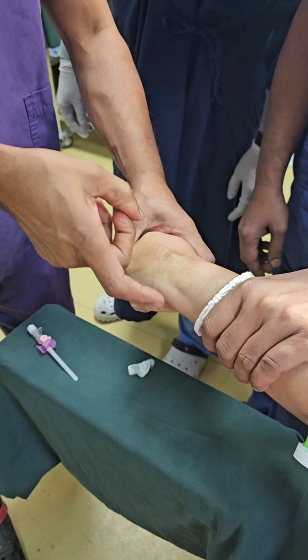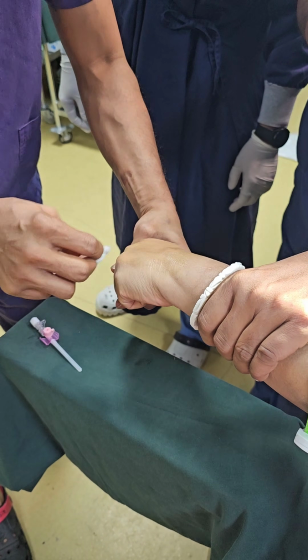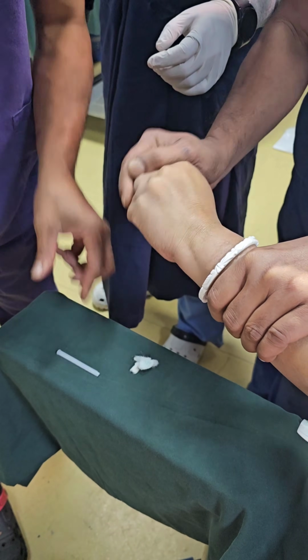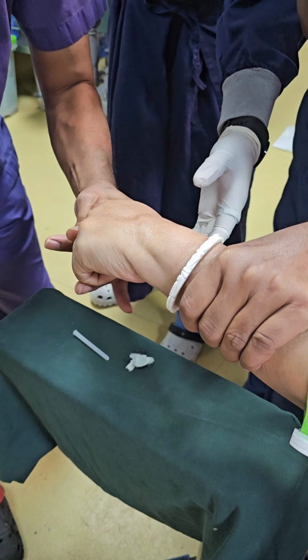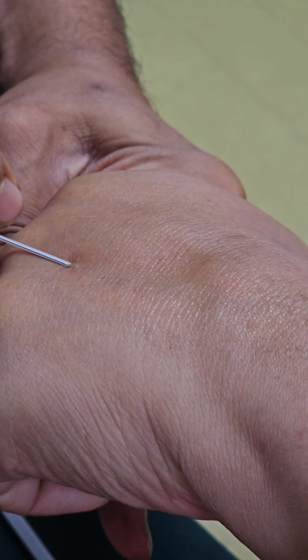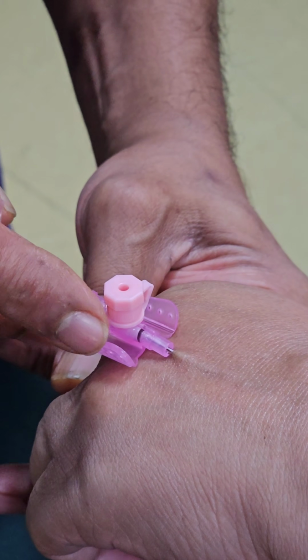Our doctors are trying to establish a secure channel and looking for other options in the dorsum of the hand, and maybe we are seeing some vein which can be cannulated. We are trying to cannulate it with a 20G cannula. We are seeing a flash of blood, and it is perfectly cannulated.